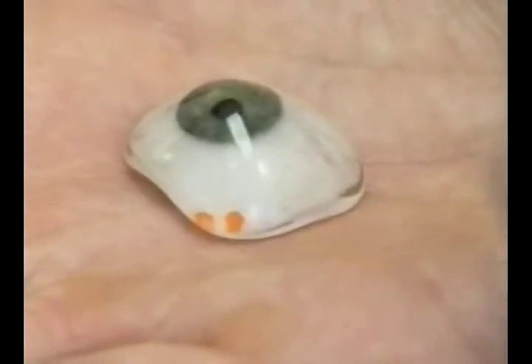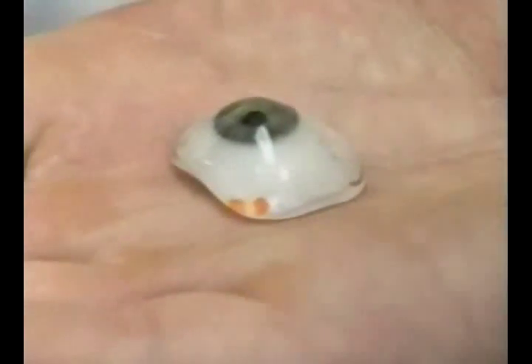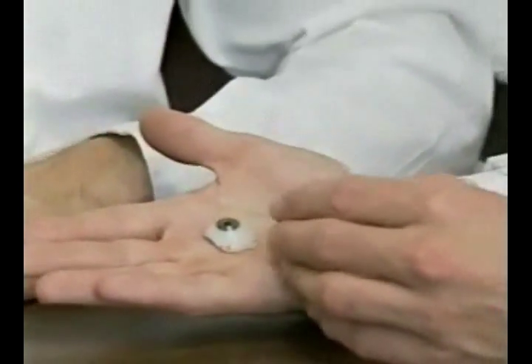The ocularist now combines the completed impression shape with the iris color to create a custom acrylic eye. Further adjustments such as veins and tinting of the white portion of the eye will also be completed at this time. A final coat of acrylic will be applied last, giving the eye a smooth, glossy surface that adds lifelike depth to the overall look of the eye. The entire process takes several hours and may take more than one visit depending on your particular case.